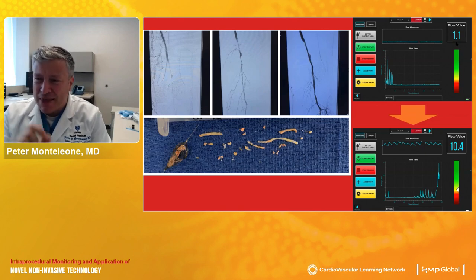great option to make that angiogram perfect, going through a couple of fractured stents with dense remaining calcium, poor runoff that would make us not want to put any more stent there if we could avoid it, this person's rest pain was gone. And you know what? This is the second case I ever did with Flomet.